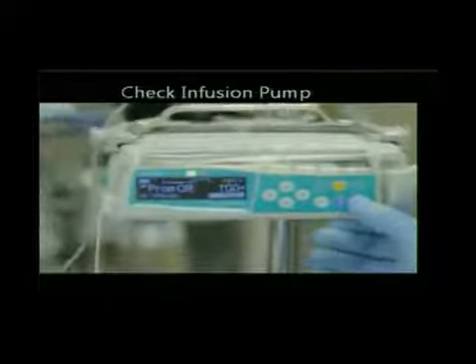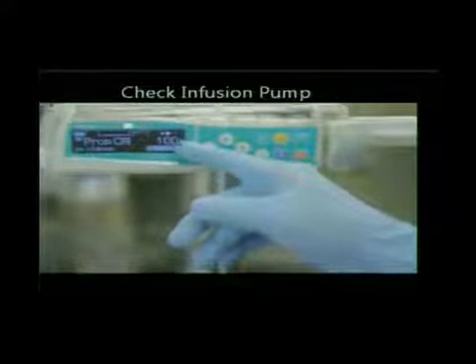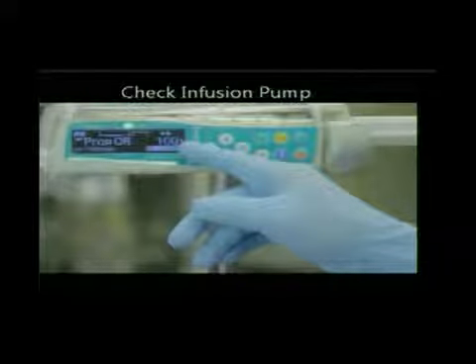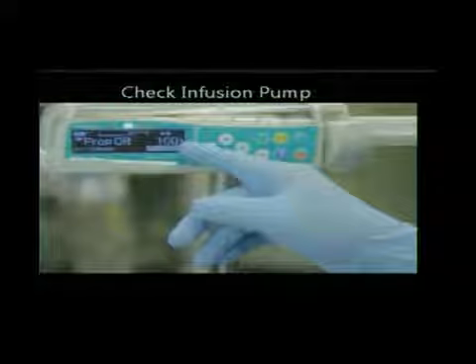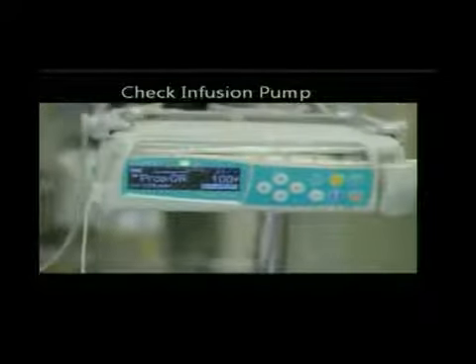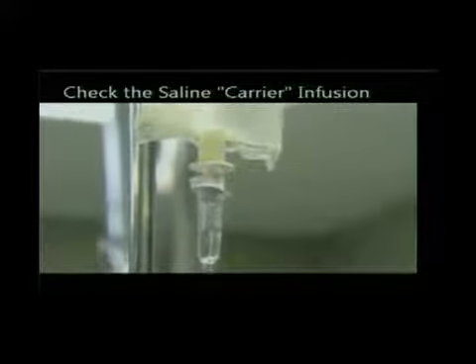You check the infusion pump, because the patient's life depends on the infusion pump giving the amount of drug you specify. Again, you can't say, oh, there's a manufacturing error. The anesthesiologist owns this. They own responsibility for the rate of the infusion and to see that the pump is doing what it's supposed to do. So you check it constantly during the procedure. Here he's checking that the pump is giving 100 micrograms per kilogram per minute, a reasonable dose for sedation, maybe a little bit high.